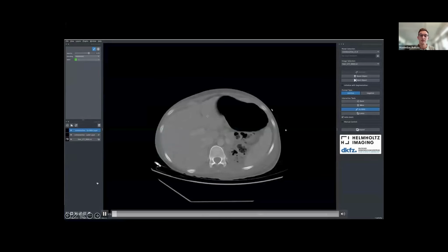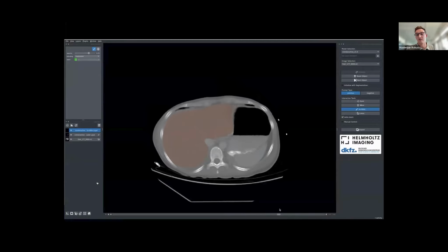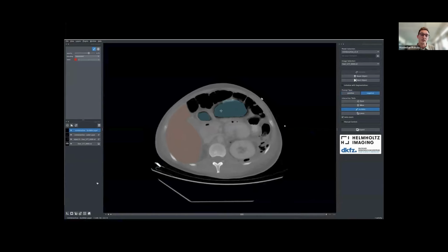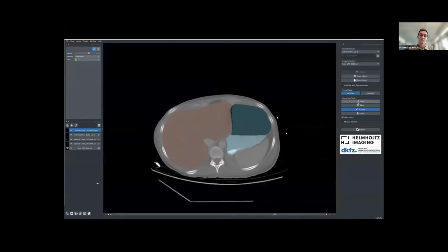But basically, what you can see here is that you are able to segment any structure you're interested in an image, in this case, the liver with a scribble prompt. Here, the stomach, again, with a scribble prompt. And if you made some mistakes, then you reprompt, and you can also place negative scribbles. Here you see some small overflow, which we can immediately remove with some negative scribbles.